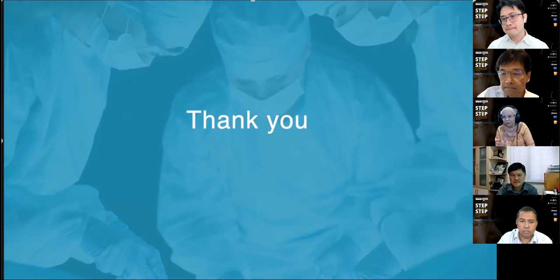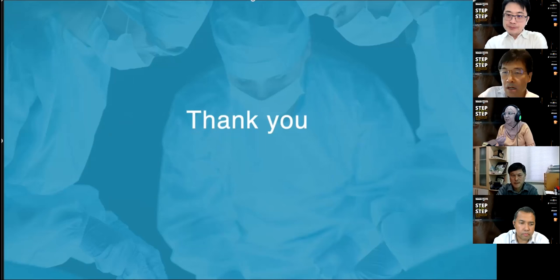The only thing that is important is the type of injector that we use. I've yet to use the COWA single injector preloaded. Hopefully on the next session I will use that one because it looks much easier to use. Surgical wise, I think it's more or less the same. So as long as you're aware which injector you're using, you can modify your technique accordingly. I think you can get YY to comment. I think he's used a few COWA.